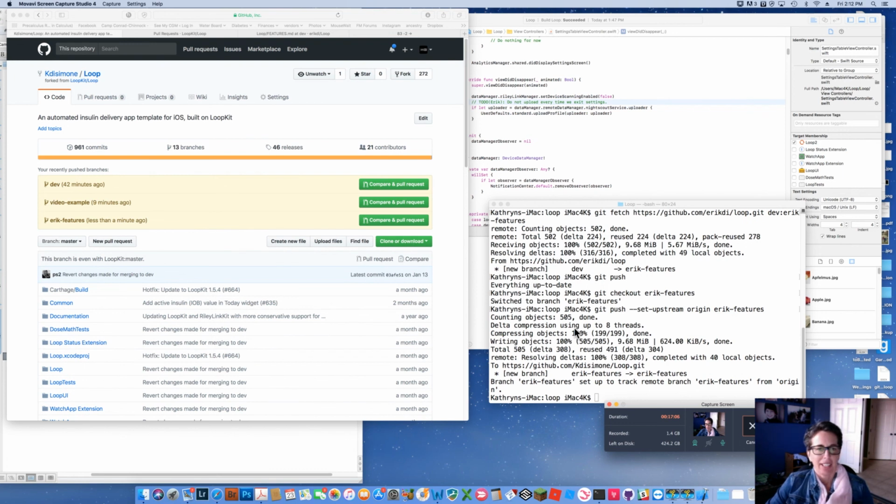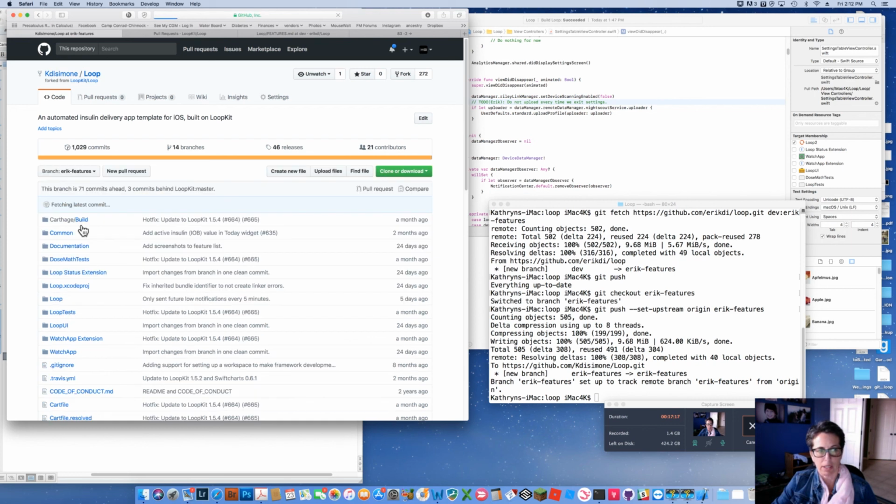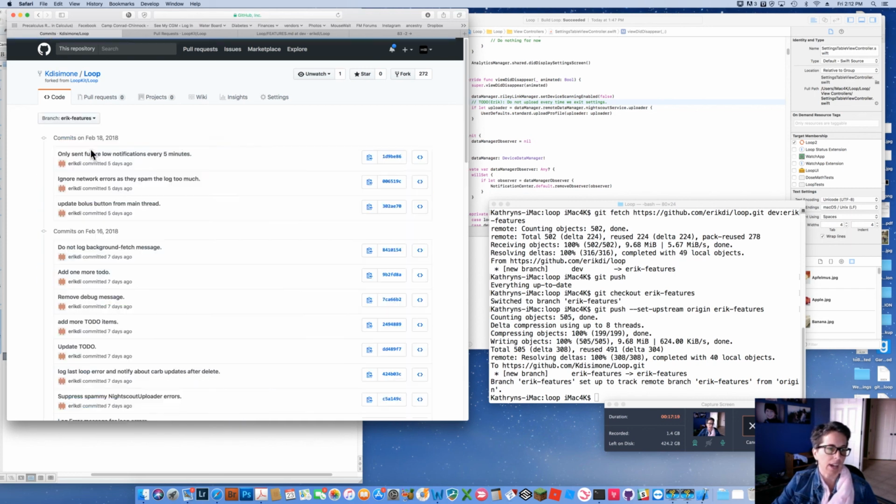Okay, I'm back. So you can see it finished, it got them all up, and now I have a branch called Eric Features, which I could play around with. I can see what his commit history was. I can go and look at it, see all the work he's done. He has quite a bit of work, which was very interesting.